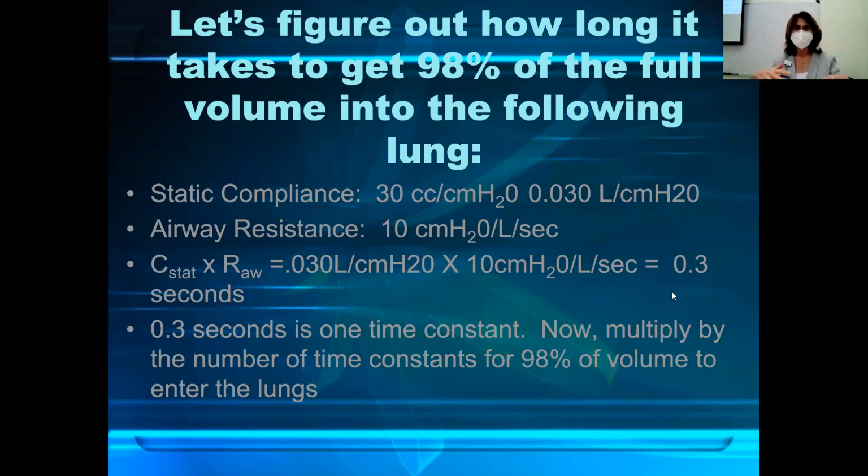All right, so as far as you guys to understand the concept about time constant, break it down to 2 things. Number 1, write down a definition. And the definition is simple. Time it takes to fill the lungs. That's simple. That's a time constant. So if I'm asking you, what is a time constant? It's time it takes to fill the lungs.